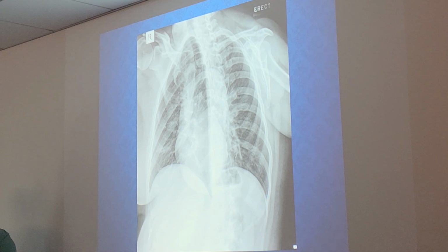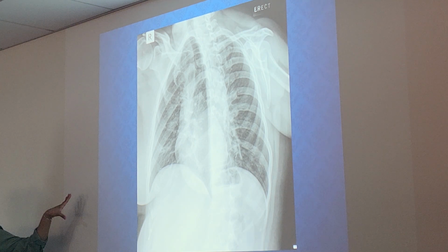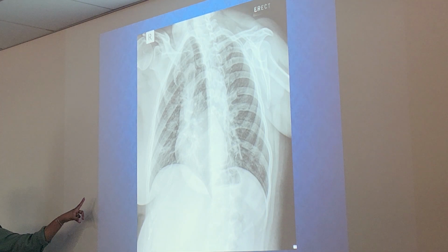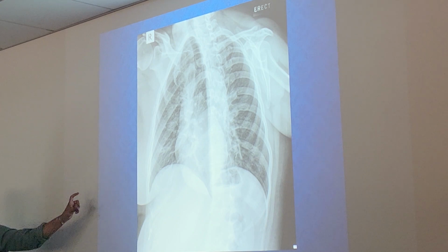Rib x-ray. First of all, what position is this? Ooh. The right is elongated, so left is touching. So first things first, we see a right marker, which tells me what? Right side is touching the IR. And you see the right ribs are elongated. So it should be what? RAO. LAO. Wait. So you said the right side was touching the IR, but the right side is elongated? Yes, you see the ribs are elongated on the right side. LAO. No?